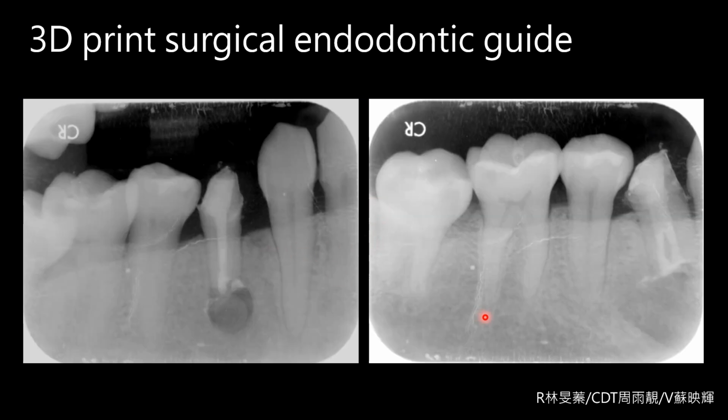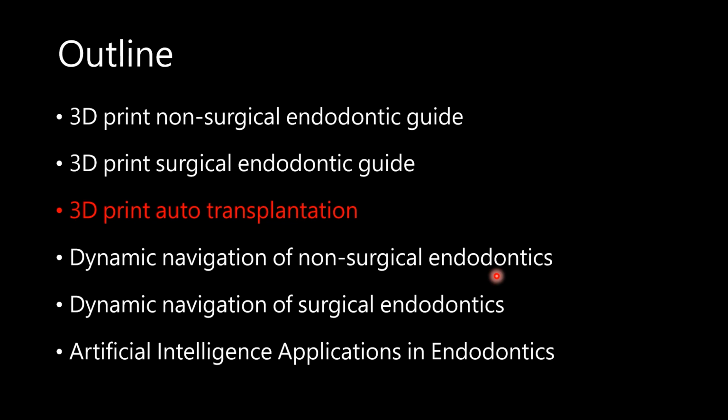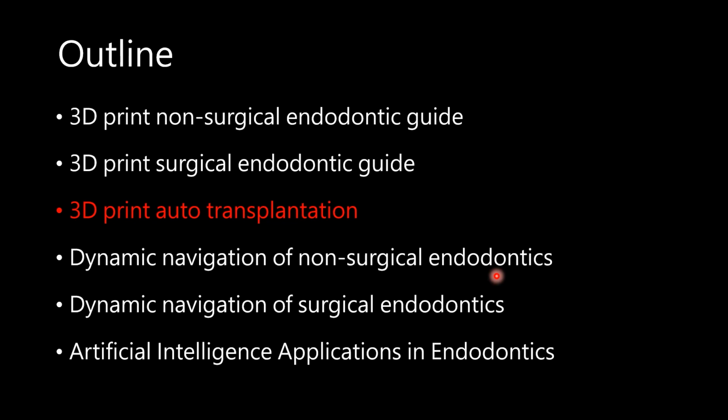And this is the postoperative. We can see the MTA retrograde filling. And this one is the 3 months follow-up. Okay, and the patient is free of symptoms. So that's the second one.